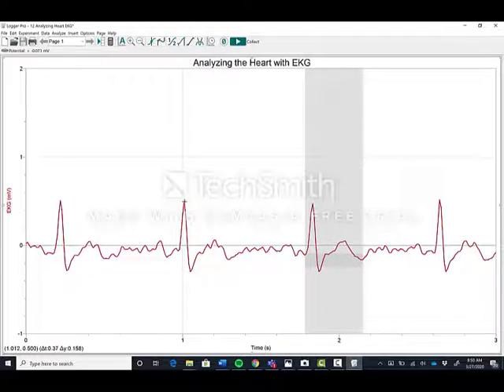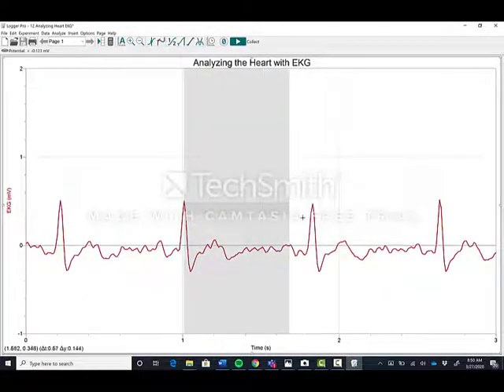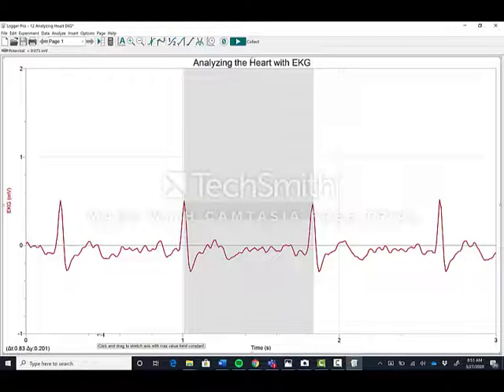Okay. One way that you can find out the heart rate. Oh, sorry. We need to do R to R. And R to R looks like it is 0.83 seconds. And so really there's not necessarily a desired range. You don't want to have tachycardia, which I mentioned in one of the audios, above 100 at resting. I can tell you from looking at this that it's not going to be above 100 at rest, although it is a little bit high.